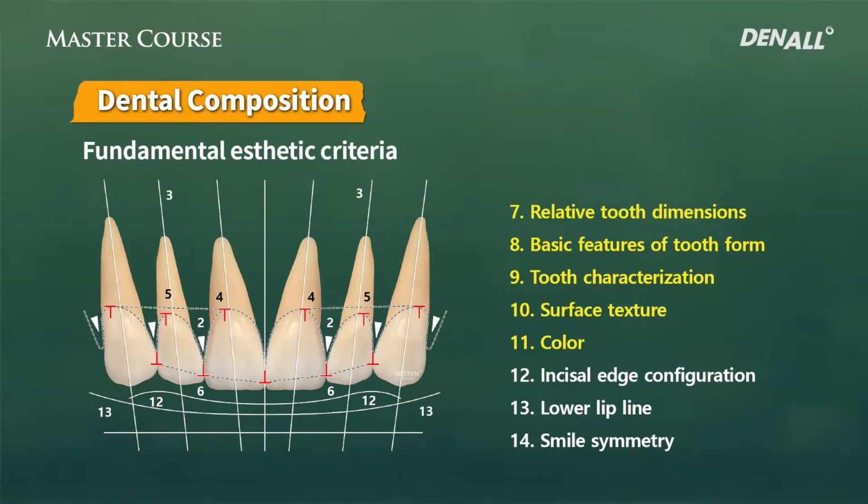We also need to look at gingiva. It is not indicated here, but in terms of the position, relatively, we need to look at the color of gingiva or the embrasure space indicated as number 2 or other gingival line, how it is composed. They need to be in harmony. White aesthetic, pink aesthetic need to be considered. The gingiva and dental composition can be understood.